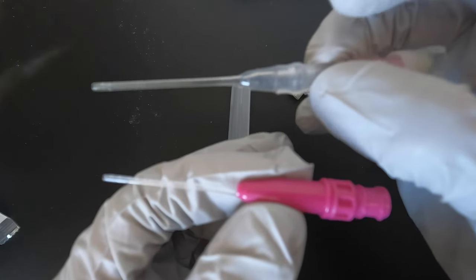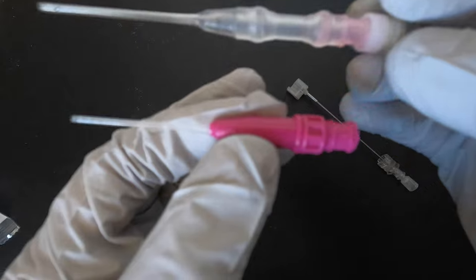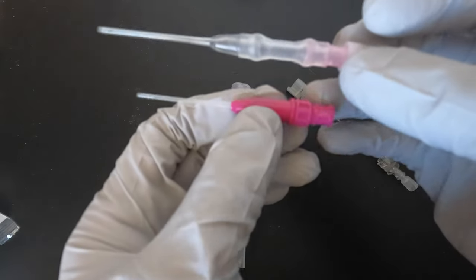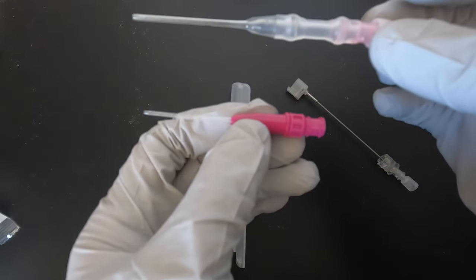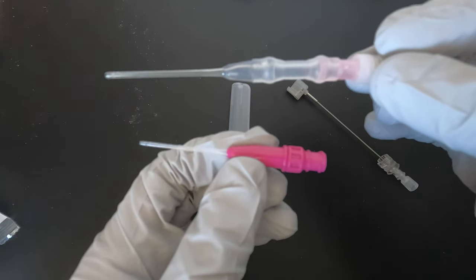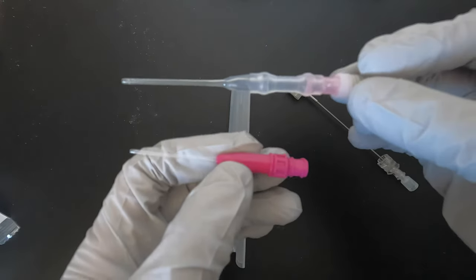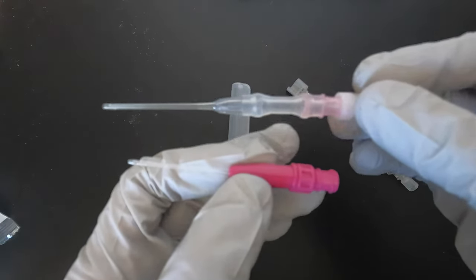So this is the difference between the two: this one is with the anti-reflux valve, and this one is without. For the one without the anti-reflux valve, you need a clamp so blood won't spill out. Now I'm going to show you the manufacturer's recommendation on how to needle and tape the needles.